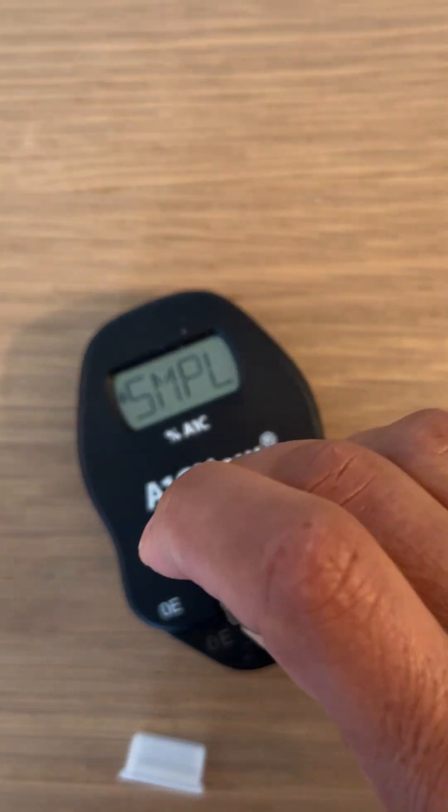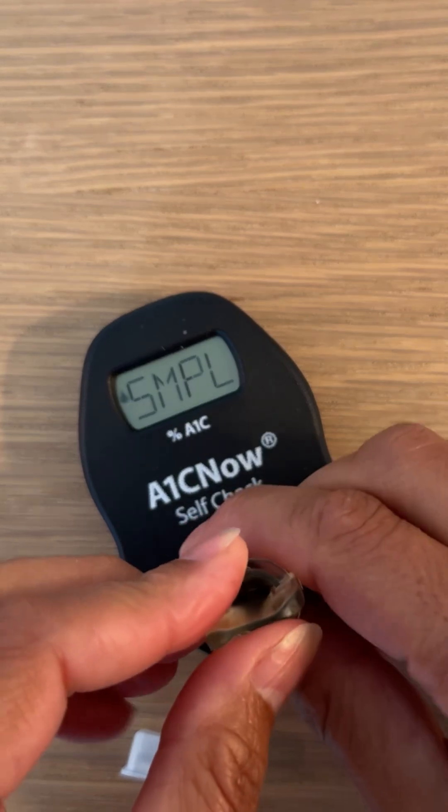There we go. You want to apply the sample to this little meter — simply press down.